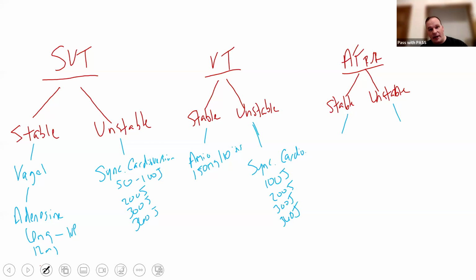When I select my energy level and I go to actually deliver the energy, you're going to charge the monitor, and then you're going to hold shock down for a few seconds until the monitor delivers the electricity. So it's not like a defibrillation where as soon as you push shock, the patient's receiving that electricity.